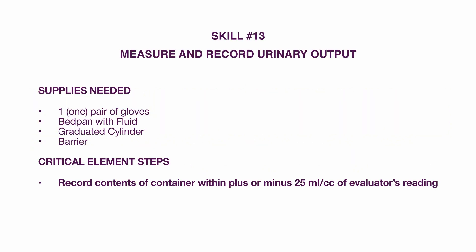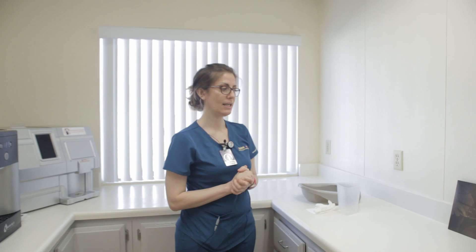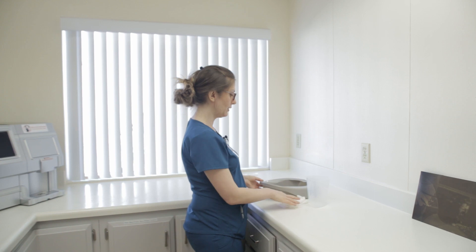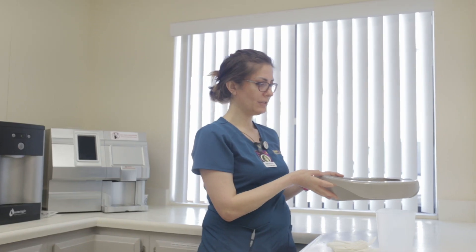Scale number 13: measure and record urinary output. Supplies needed: one pair of gloves, bedpan with fluid, graduated cylinder, and a barrier. The critical element step is to record the content of the container within plus or minus 25 milliliters of the evaluator's reading. Wash your hands and gather your supplies. For this particular skill, you are measuring the urine output — the urine liquid will already be in the bedpan.